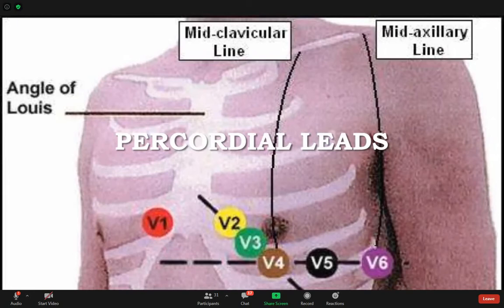The right foot we don't use it for anything, بس يعتبر نسميها just يعني base negative or a ground electroid آسف. دائما احنا نتلخبط بين الليدز والالكترويدز.